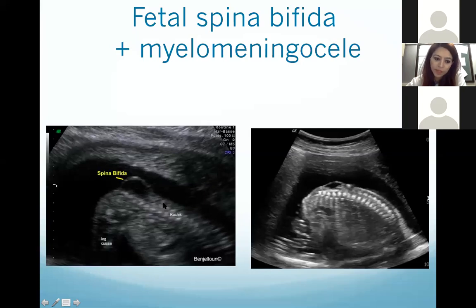This is another case of spina bifida with a myelomeningocele projecting into the amniotic cavity with a small membrane over it.